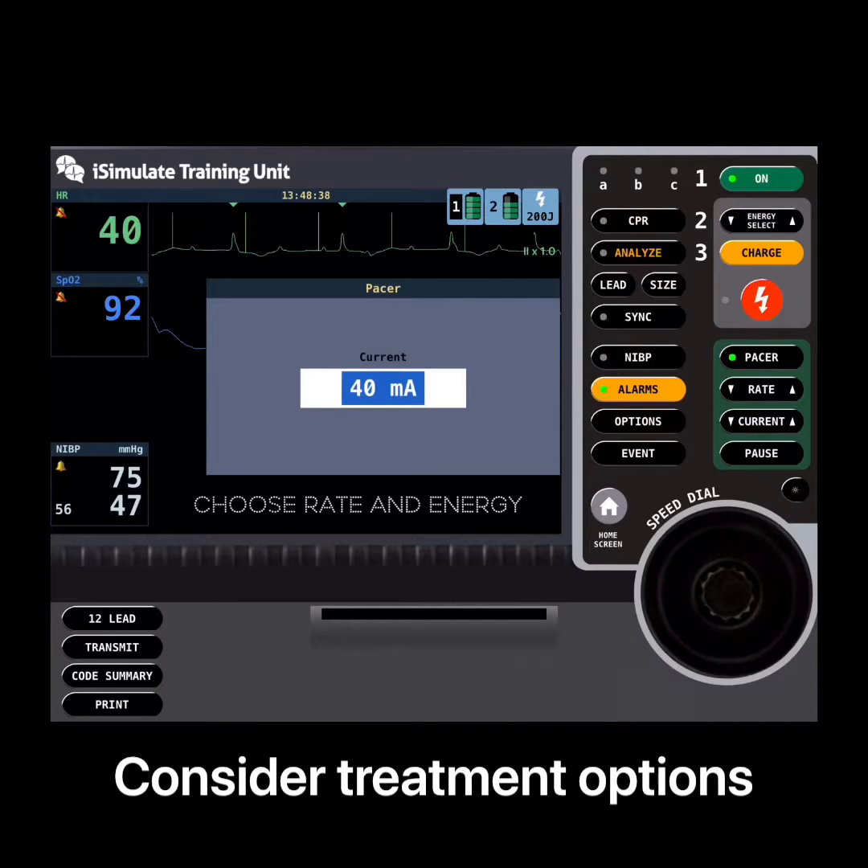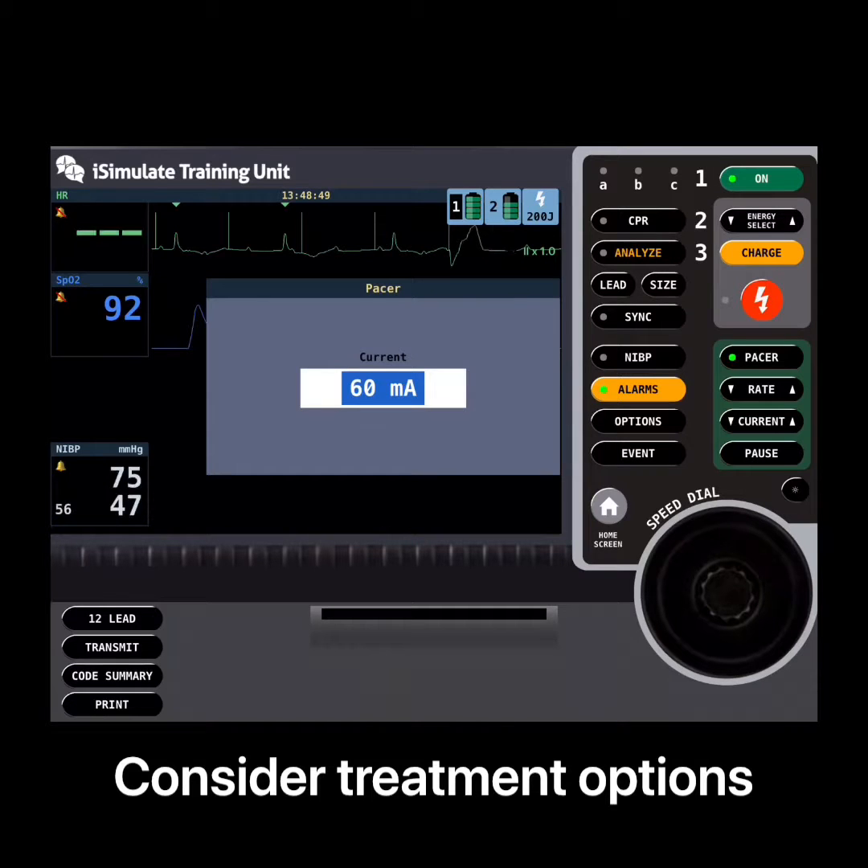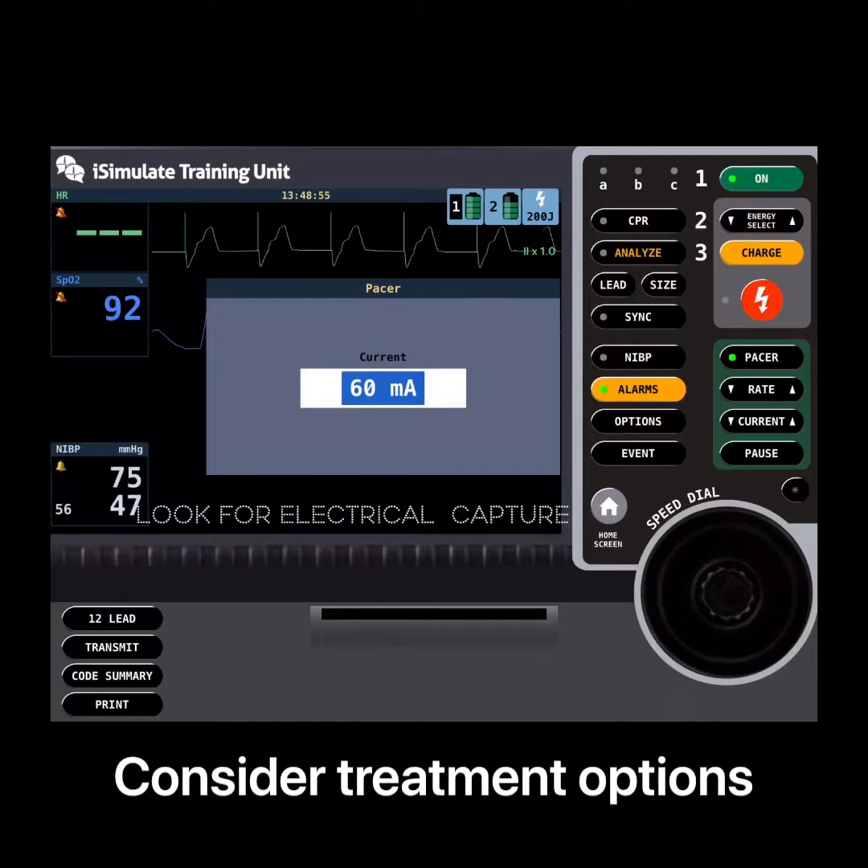They chose a rate that they wanted to work at and then you see them clicking up through the energy here until they get electrical capture. Each of the beats is followed quite nicely — you can see electrical capture taking place. They then confirmed that by checking the patient's pulse and found that they had mechanical capture as well, so the pulse matched what they could see on the ECG.